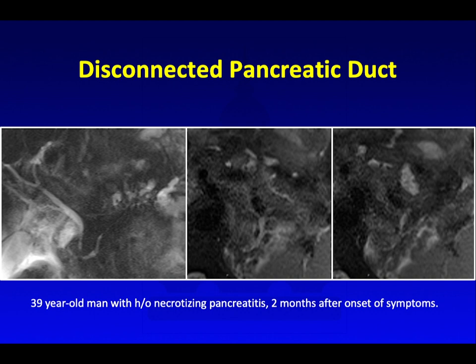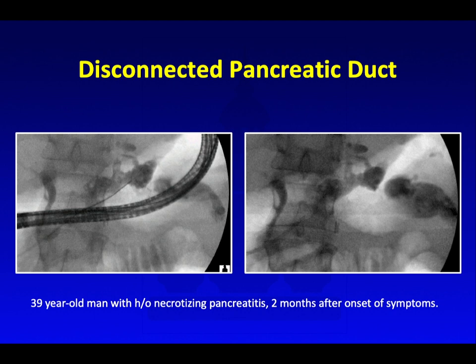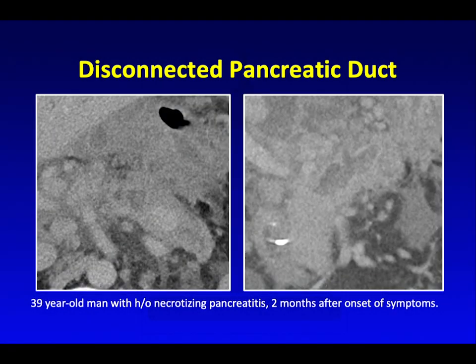In this patient with a history of necrotizing pancreatitis two months after symptoms, on the MRCP image, we can see the pancreatic duct within the head, but more distally within the body and tail, the duct is not well seen, and we see peripancreatic collections. It is very difficult to make the call of a disconnected pancreatic duct on MRCP alone. On ERCP after injection, they saw a very irregular tubular collection interpreted as the dilated pancreatic duct. The patient also underwent CT, and on CT we have limited ability to evaluate the pancreatic duct, making it very difficult to determine whether the collection is connected to the duct.